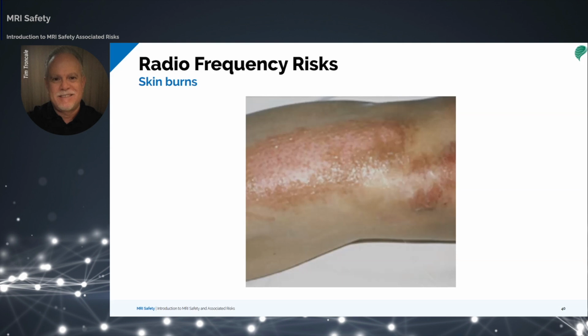Also, some of today's athletic wear and undergarments have elements and components in them that are subject to heating during the MR exam, such as copper, aluminum, and some polyesters that have wicking or antimicrobial properties. Therefore, according to the ACR, it is advisable to require that all patients or research subjects wear site-supplied MR-safe scrubs or gowns in place of their own clothing and undergarments in the region undergoing direct RF irradiation.